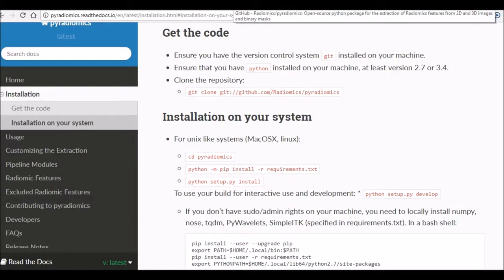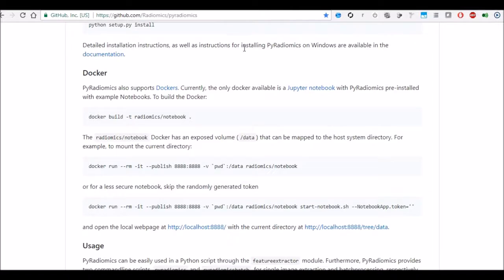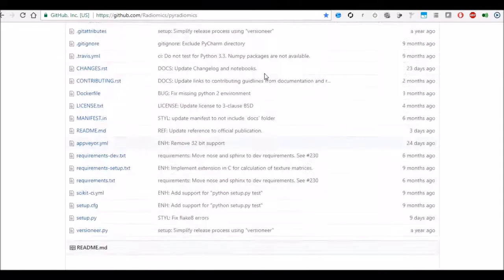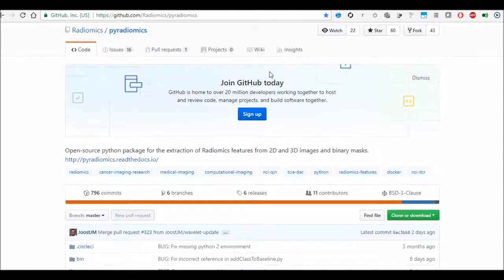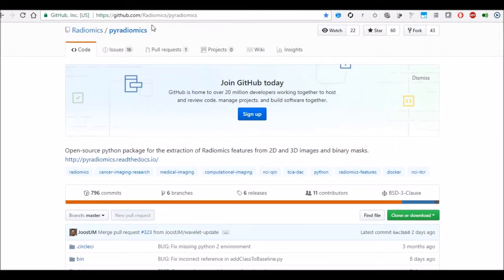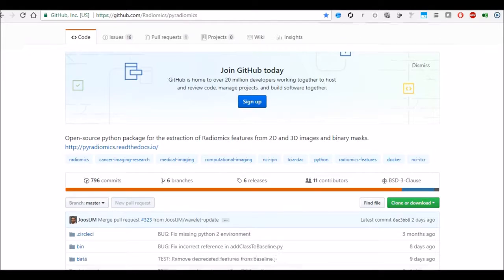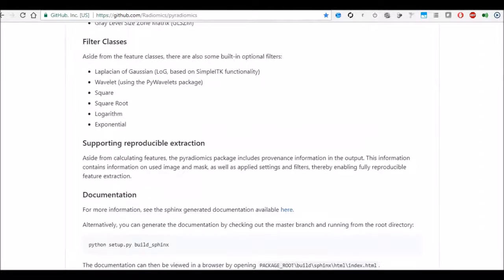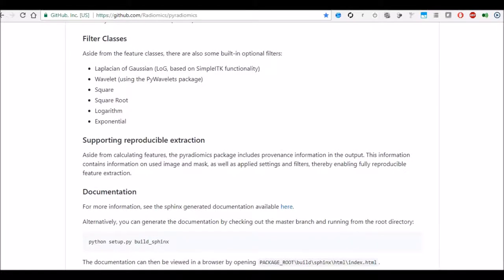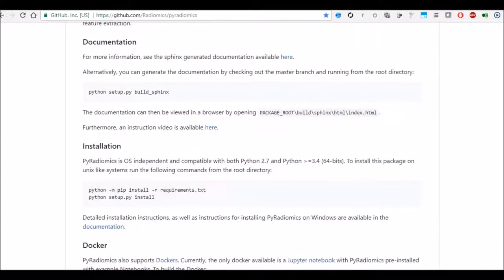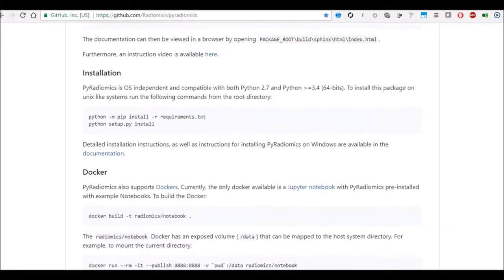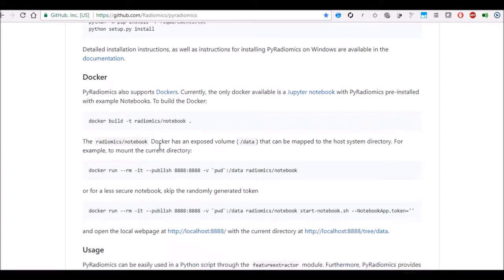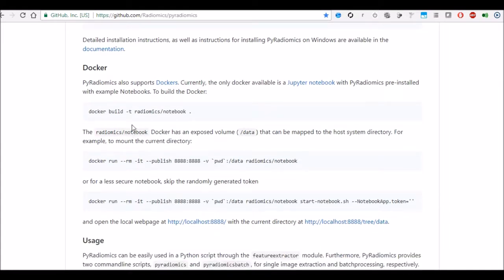So now I will switch gears to looking for alternative methods to python-based installation. So if you go to GitHub for pyradiomics package they have provided some additional options on how to install it. Obviously previously we talked about using python pip to install the package. The other new technology which has come up is called docker.